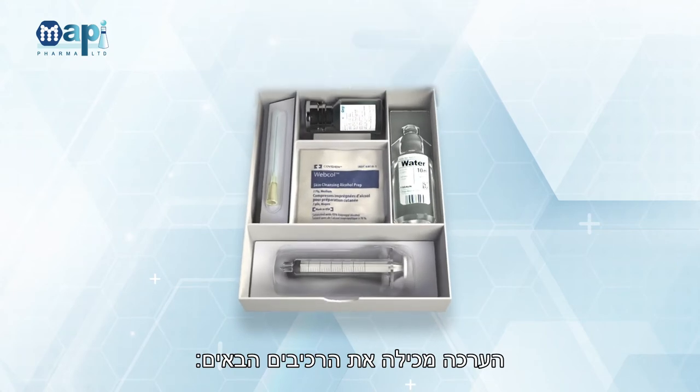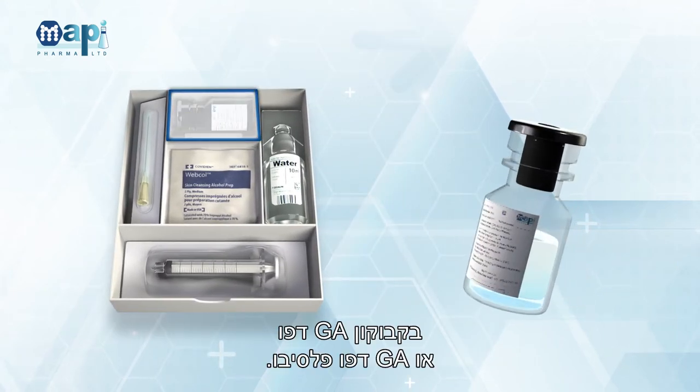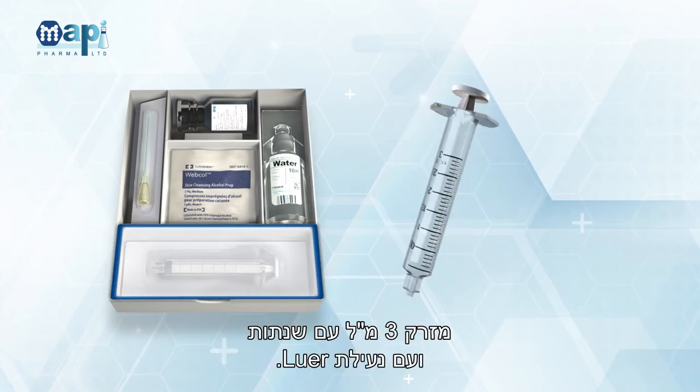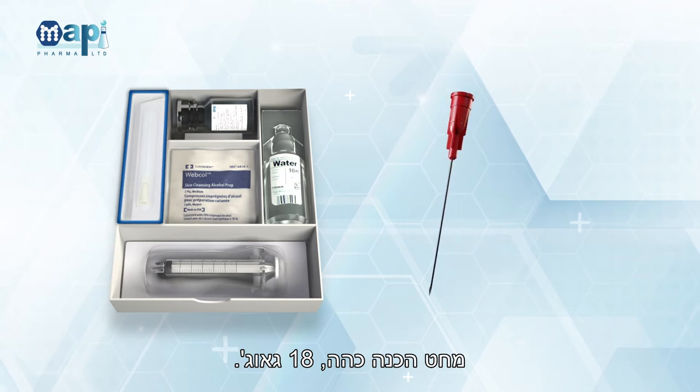The kit contains the following: GA Depot or GA Depot Placebo Vial; 10 mL Sterile Water for Injection (WFI) Ampoule; 3 mL Graded Syringe with Lure Lock; Blunt Preparation Needle, 18 Gauge.